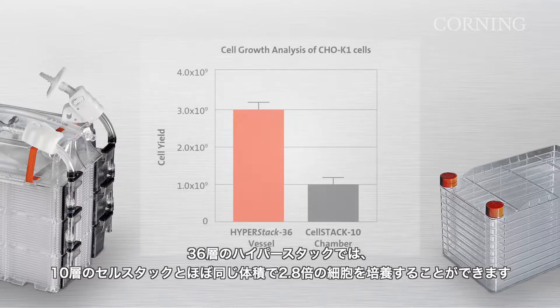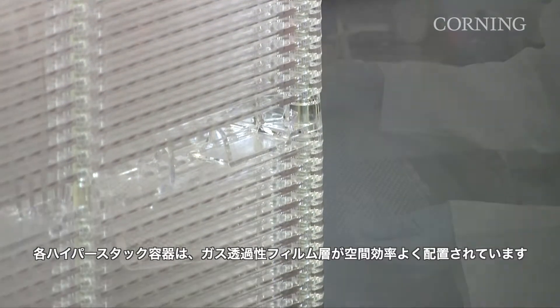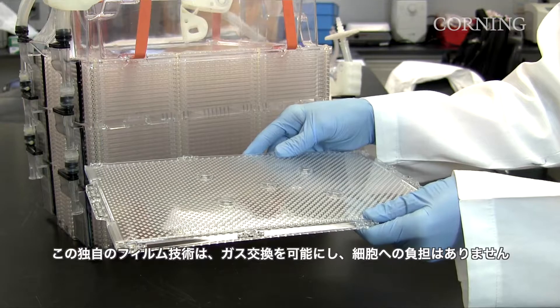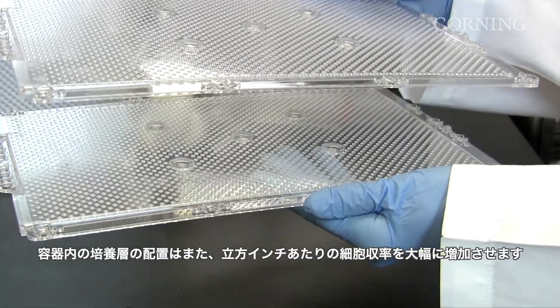With one 36-layer HyperStack, you can grow 2.8 times as many cells in about the same cubic footprint as in one 10-layer cell stack. Each HyperStack Vessel has a space-efficient arrangement of gas permeable film layers. This proprietary film technology enables gas transfer so your cells never suffer, and the arrangement of layers within the vessel also substantially increases cell yields per cubic inch.